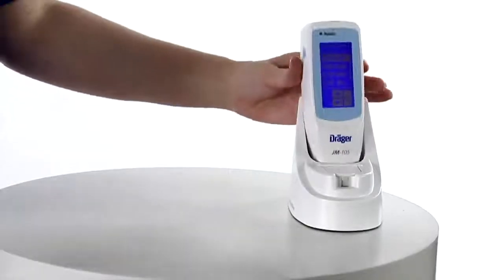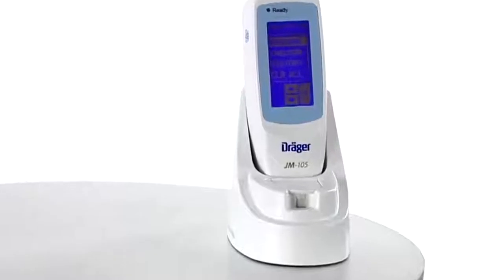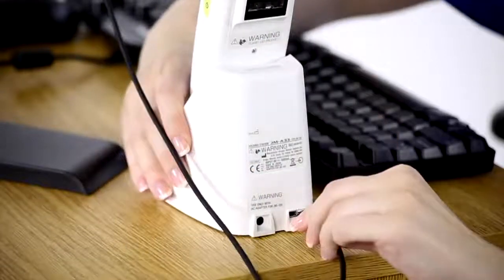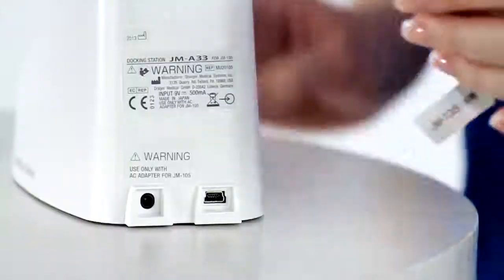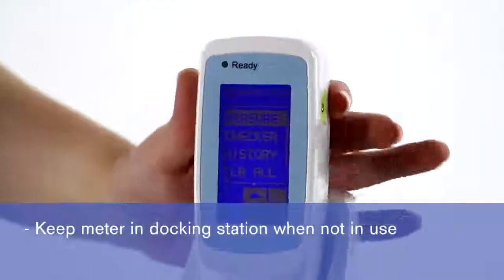The JM105 rests in a docking station when not in use with the display facing forward. The docking station allows the JM105 battery to be recharged. The docking station is connected to a power source either by a USB cable to a computer or with an AC adapter, plugged into an electrical outlet. The JM105 should be returned to the docking station when not in use to keep the unit charged.